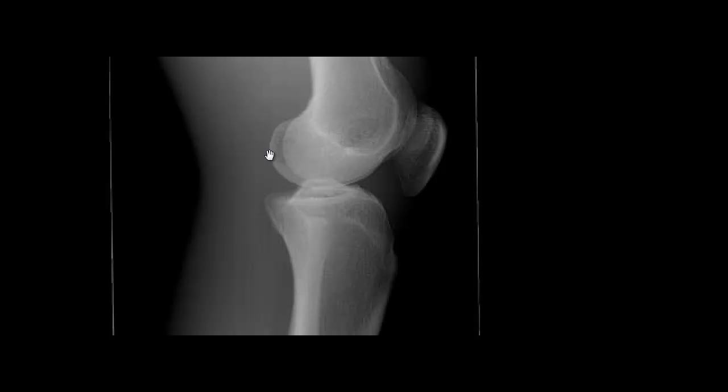If I picture my foot in a true lateral position, my toes may have a little more distance from the table than my heel. To fix that, I'm going to turn my foot externally, which in turn turns the whole leg externally. This will bring the medial condyle — which is currently posterior — more anteriorly to superimpose the lateral condyle.